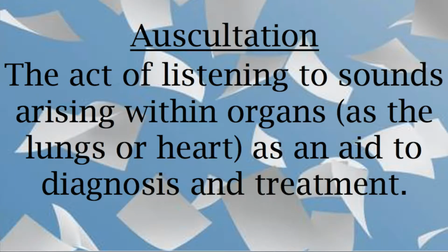Auscultation is the act of listening to sounds arising within organs, as in the lungs or the heart, as an aid to diagnosis and treatment. Today, we'll be specifically talking about lung auscultation.